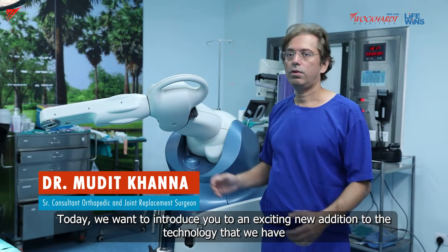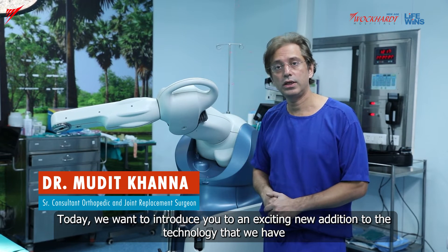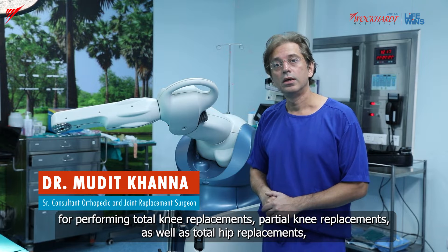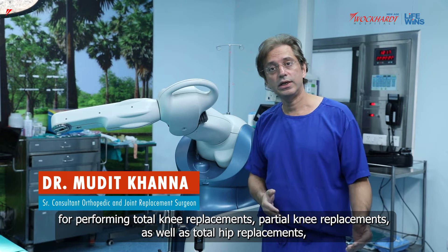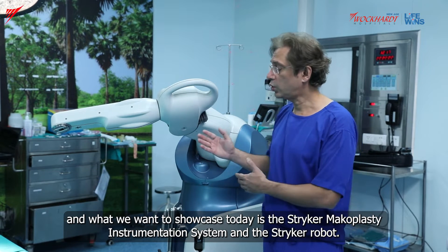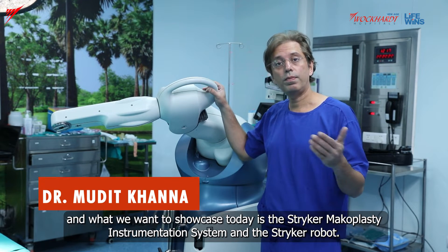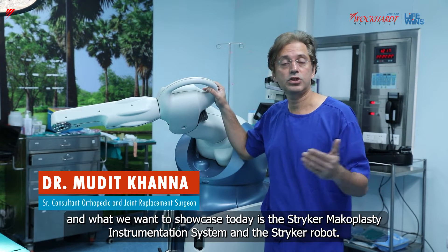Today we want to introduce you to an exciting new addition to the technology that we have for performing total knee replacements, partial knee replacements, as well as total hip replacements. What we want to showcase today is the Stryker Mako Instrumentation System and the Stryker Robot.